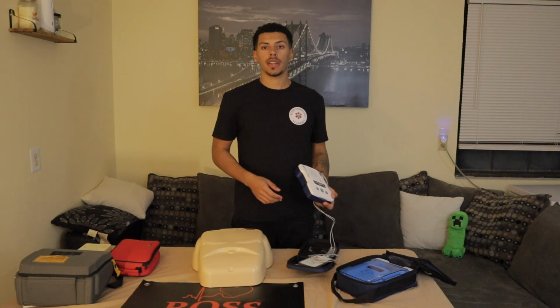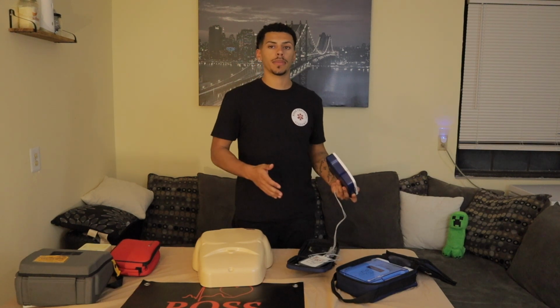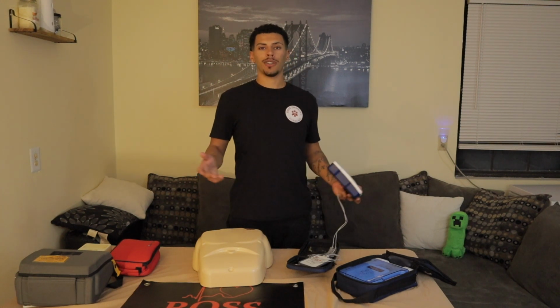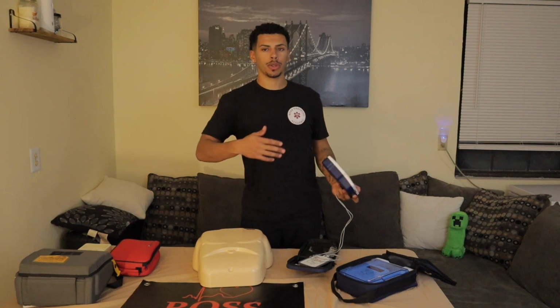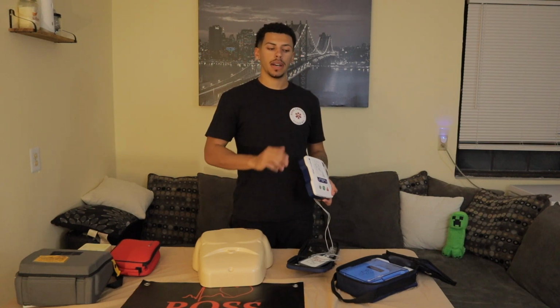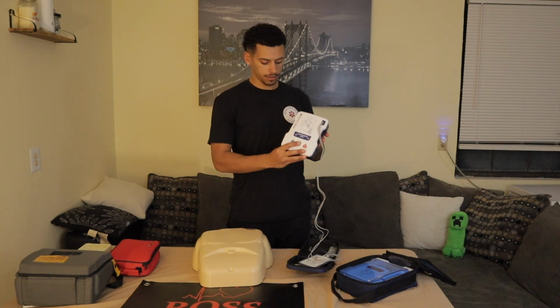So, like I was saying before, I brought my mannequin up here just because the pads need to be on something for them to work, whereas some of these other ones, all they need to do is just be turned on, and then it'll go through the prompts. This one will not go through any prompts unless the pads are on. So, let's go ahead and just turn the machine on.